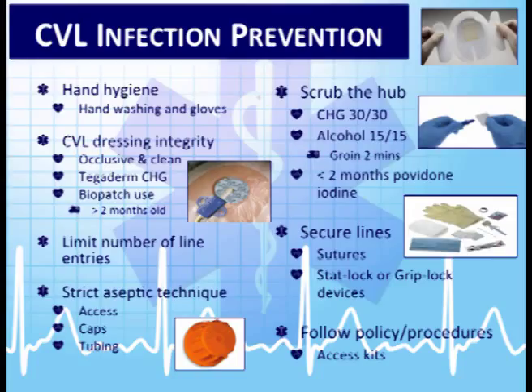Each hospital, each facility is going to have their own policies, procedures, and guidelines on central line access, maintenance, care, and changing the dressings, but it's pretty universal that if it's not an occlusive dressing and clean, that it needs to be changed. Limit the number of line entries.